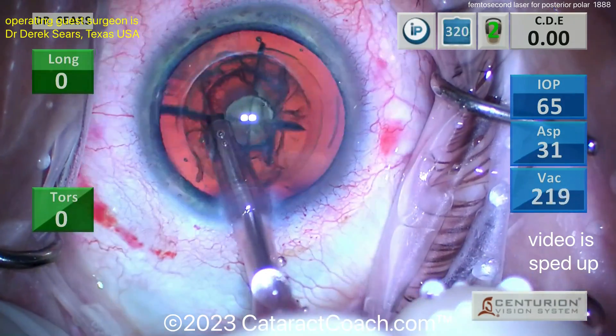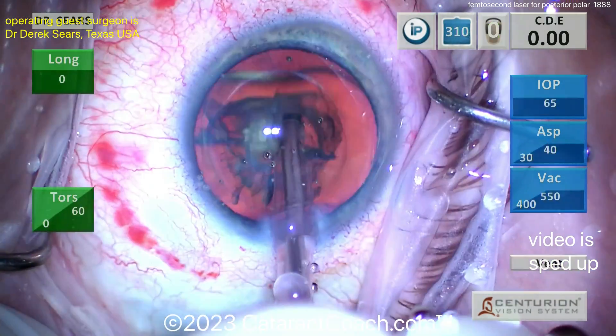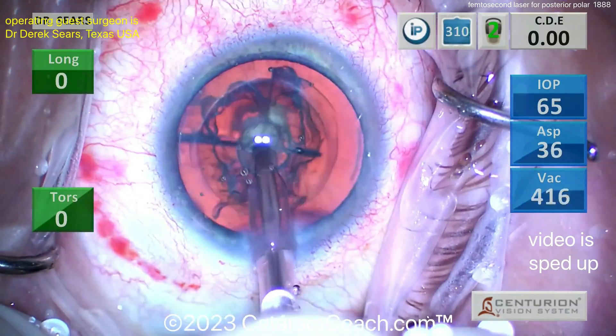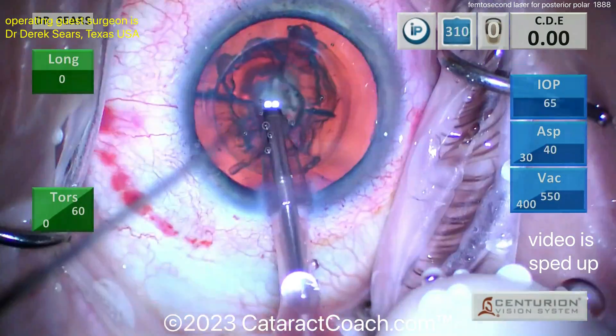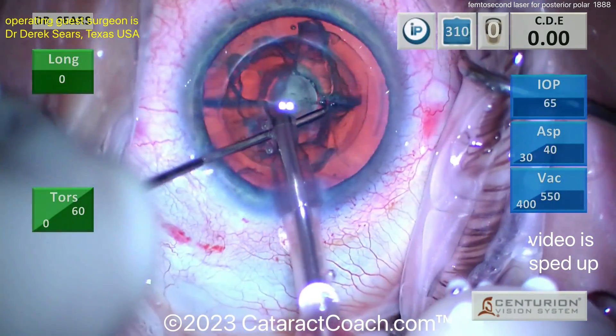Bringing them up, maybe a second hand to help bring them out of there — that looks good, removing those very nicely. Once those quadrants are out you'll be left with that big epinuclear shell and the cortex. Let's see the technique here.